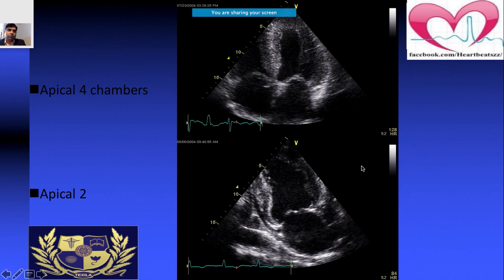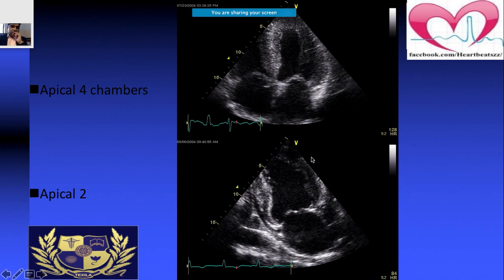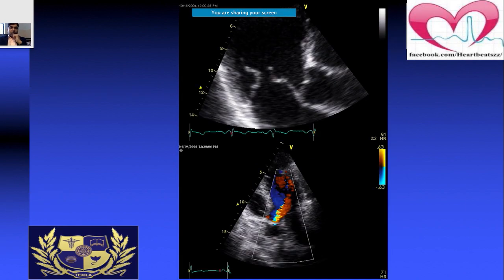In the apical two-chamber view, you visualize the anterior and inferior walls. This is very useful when you suspect a patient has had an infarction — you can go to those segments and visualize the anterior wall as well as the inferior wall.